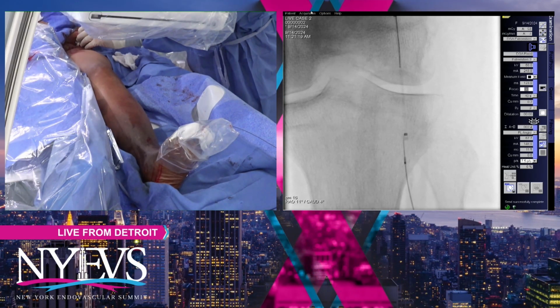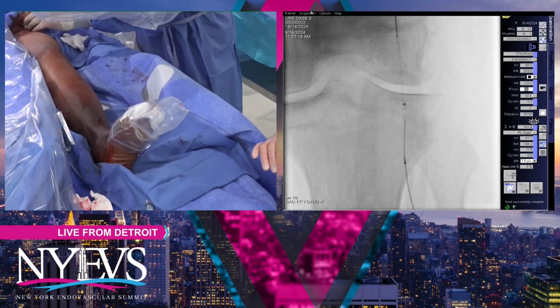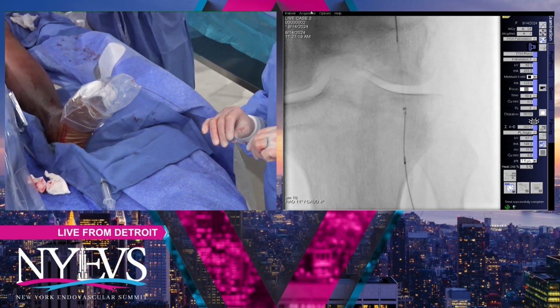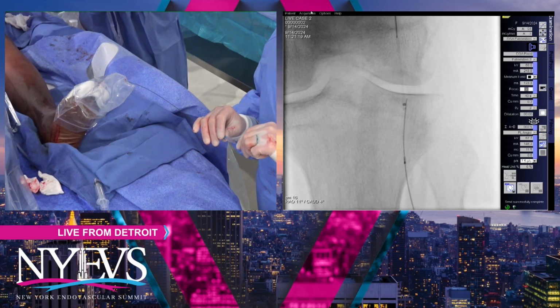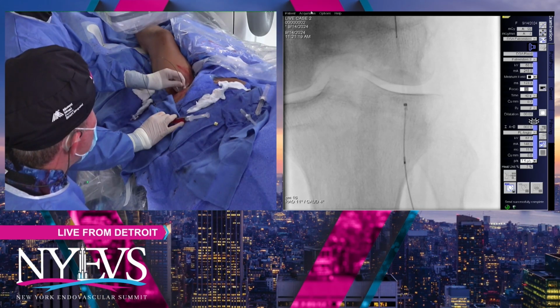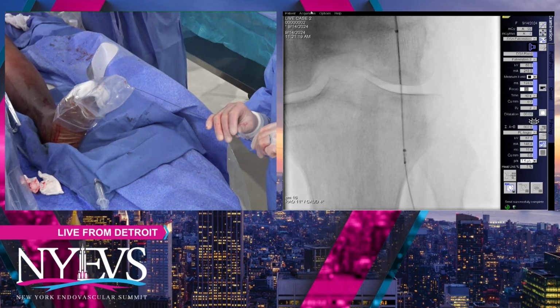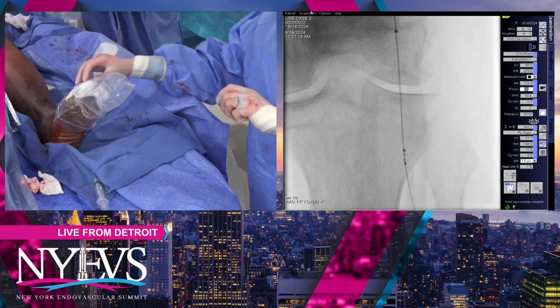I think it really depends on the quality of the dorsalis pedis. If that's a very calcified dorsalis pedis, then certainly I'm going to try not to stick it because it could be problems potentially. So generally speaking, I think a couple of minutes from the top and know your limits. And if it's not working, then just hit the bottom.